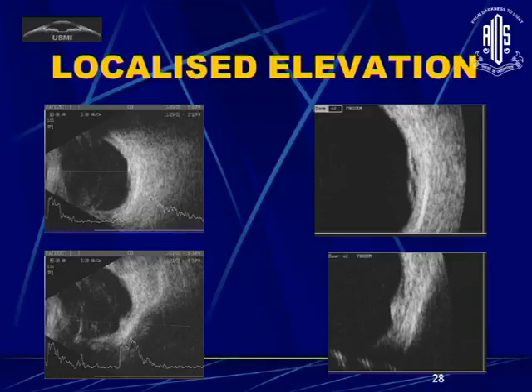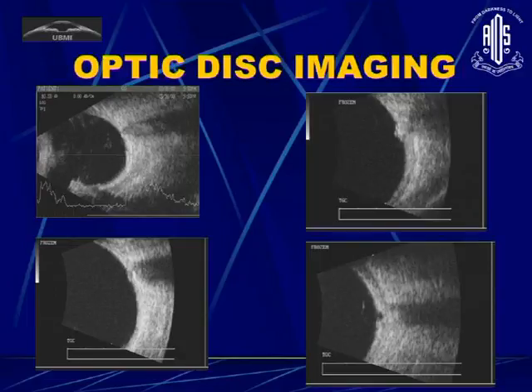I put the same patient here on a 20 megahertz probe. I can see that this is just an elevated retina with some amount of subretinal fluid. We can wait for some time, it will probably get resolved on its own. Where this lesion still remains solid, there is no fluid over here. This fellow needs to be followed up, probably a development of an early melanoma. So that's how the 20 megahertz helps.